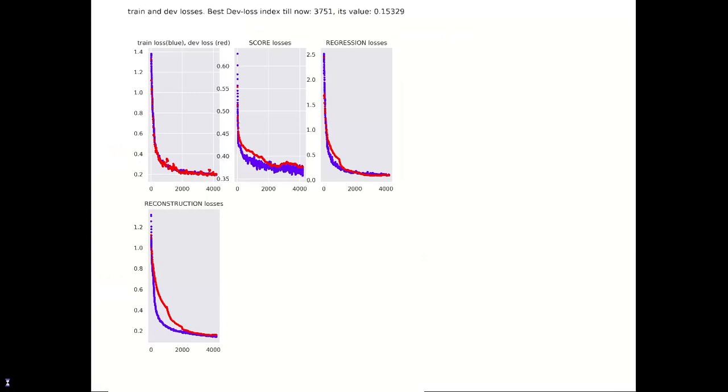Overall, this fully convolutional model had roughly 7 million parameters. The model was trained for 4,000 training steps on a single GPU machine. Small mini batches of 3 compound samples were used as described. Mild dropout of 0.2 was used to assist in preventing overfitting, yet the chain reconstruction part of the model was really the one responsible for successfully preventing overfitting and memorization.